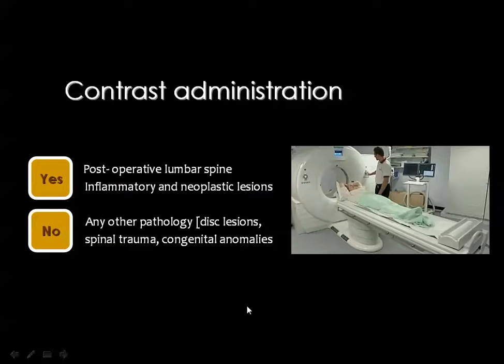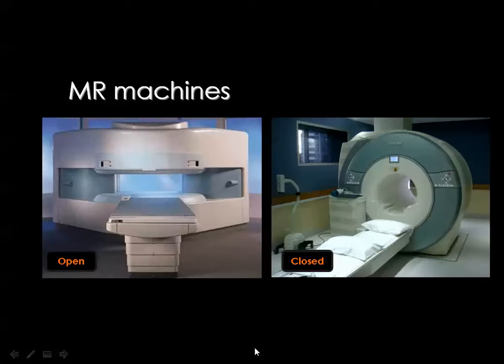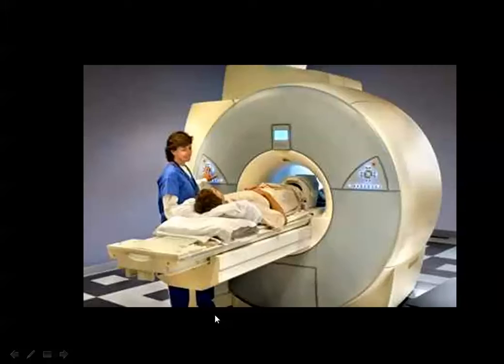Contrast injection is not usually needed for evaluation of disc pathology, in cases of spinal trauma, and some cases of congenital anomalies.